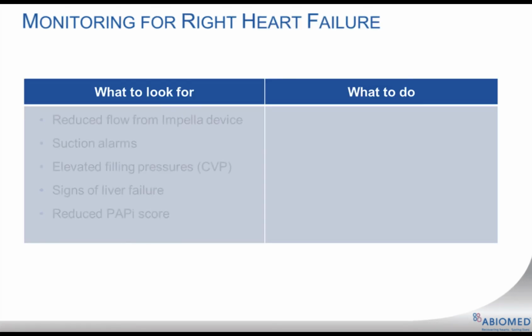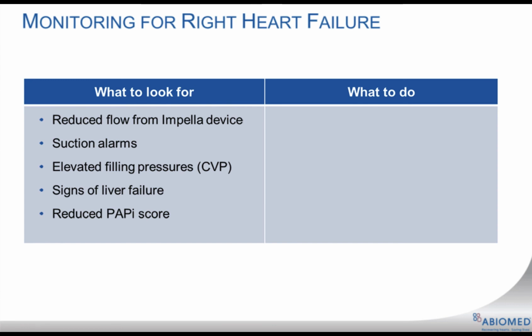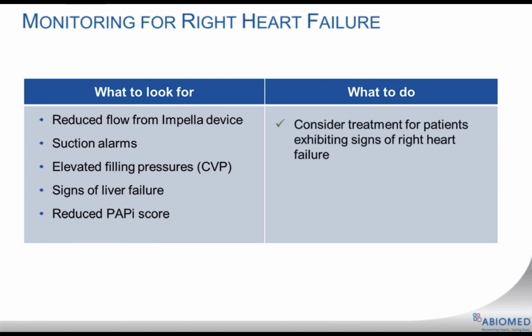Monitor patients being supported with the Impella device for signs of right heart failure. Look for reduced flow from the Impella catheter, suction alarms, elevated filling pressures, signs of liver failure, reduced PAPI score. If a patient exhibits any signs of right heart failure, consider standard of care treatment.